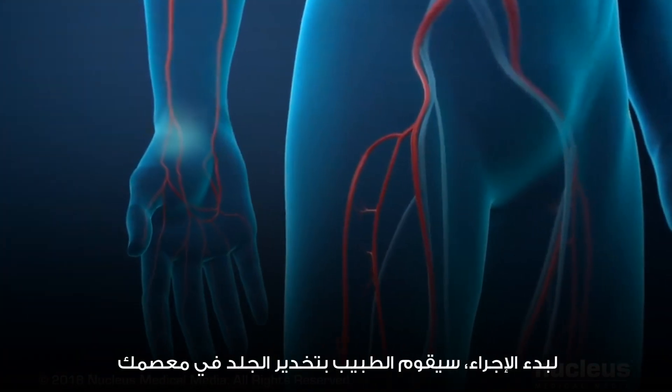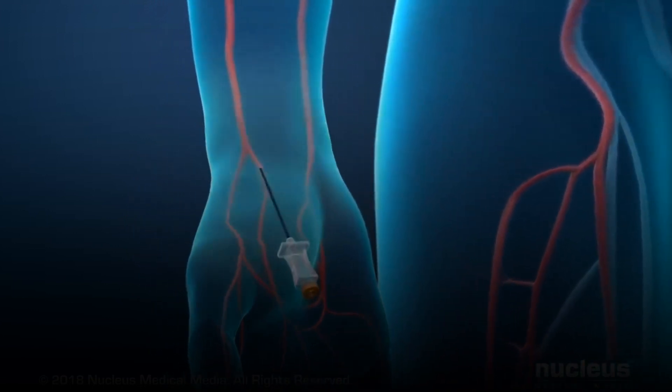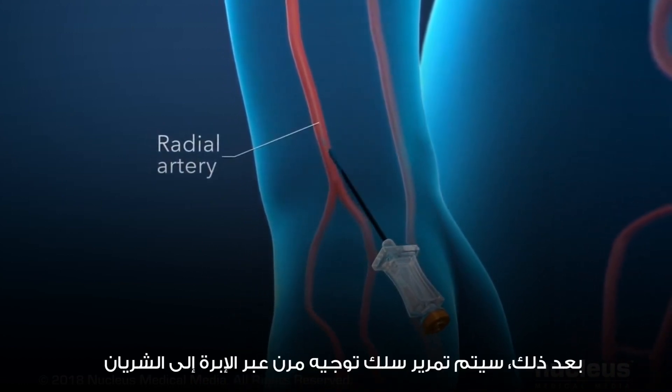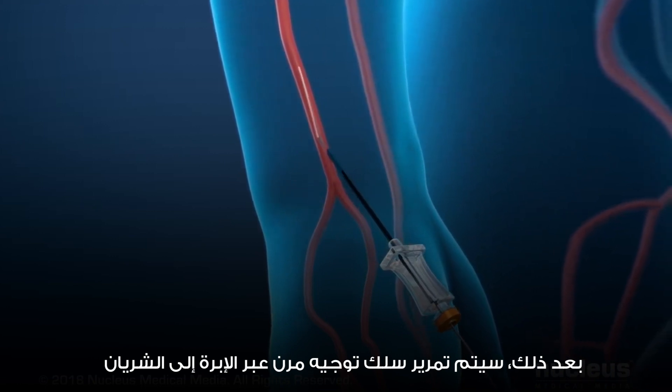To begin the procedure, the doctor will numb the skin in your wrist. A needle will be placed through your skin and into your radial artery. Next, a flexible guide wire will be passed through the needle into your artery.